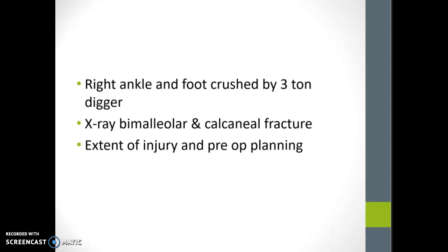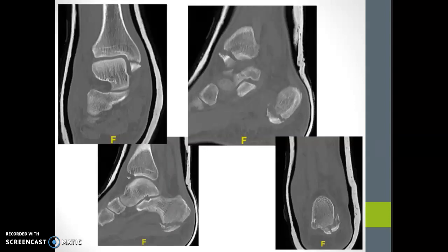Looking at this case study, a patient with right ankle and foot crushed by a 3-ton digger, X-ray confirmed bimalleolar and calcaneal fractures. So what they're trying to do with the CT is plan the extent of the injury and what they're going to do pre-op. So you can see here you've got a calcaneal fracture, malleolar fracture here, calcaneal fracture, malleolar fracture there.